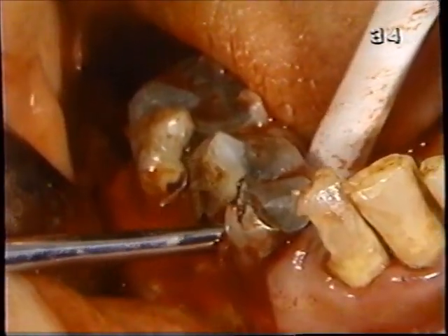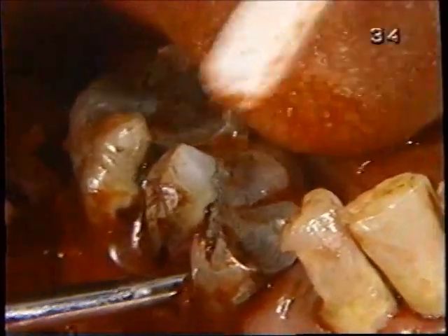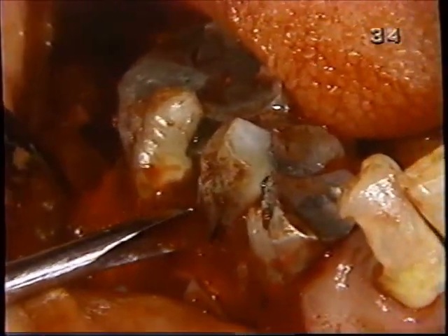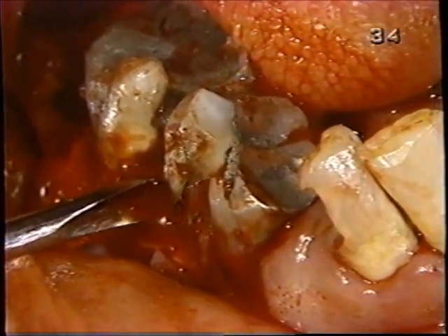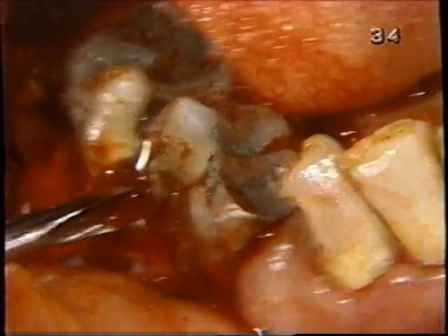And I think by luxating here with a 301, we're probably luxating 28 as much as 29, so we don't want to do that. Similarly, let's try on this side. We can fulcrum a little against the molar because it's so much stronger, but if we use very much force, that tooth will just break off right at the gum line, just like the second molar did. I mean, the first molar will.